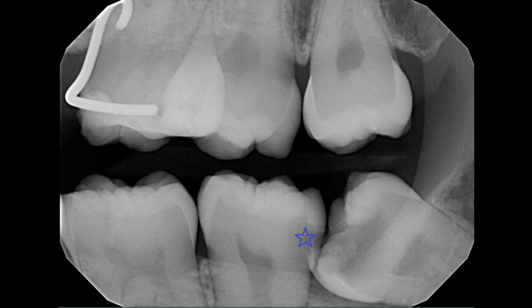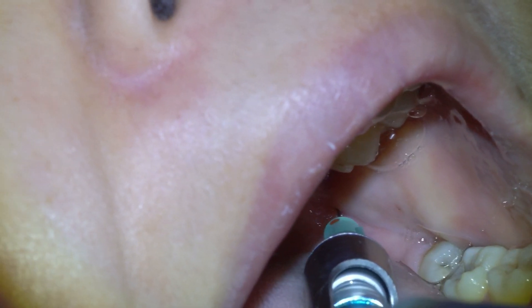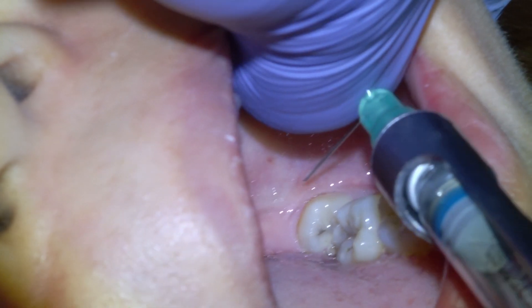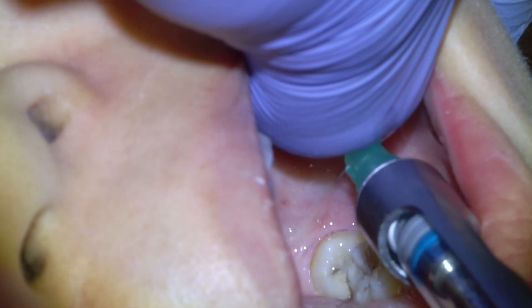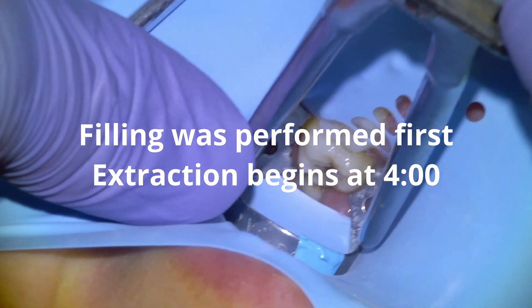We're going to begin by administering one cartridge of articaine into the mandibular nerve and then a quarter of a cartridge into the long buccal nerve. I'll typically give it a few minutes and then go back in and supplement with another cartridge or two.